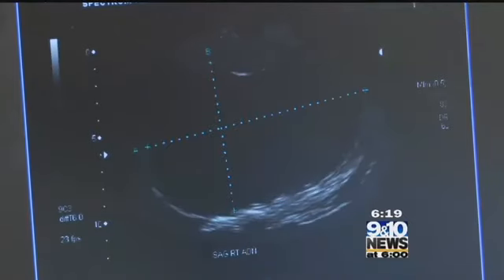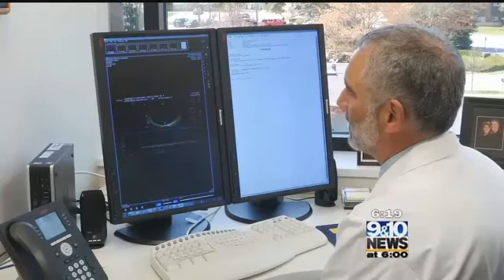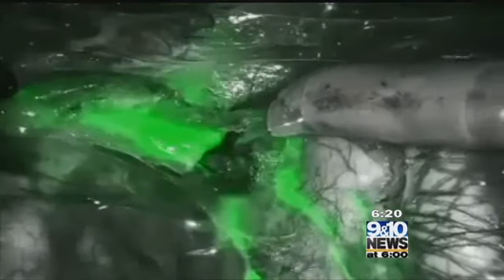In the past, doctors played more of a guessing game, taking up to 30 lymph nodes out of a patient. We've become more selective and more sensitive in terms of what we do. We can select the one positive lymph node on each side and then along the aorta, and like I said, perhaps take 3 lymph nodes as opposed to 30. That means shorter surgeries, fewer complications, and less risk overall. It really has been a game changer for us.